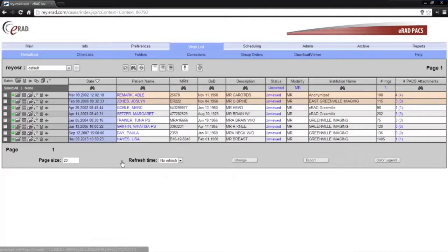This video is intended to highlight the main eRAD PACS software version 7.2 features and enhancements.